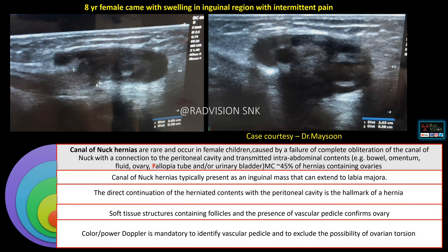Canal of Nuck hernias are rare and occur in female children — this is due to failure of obliteration of the Canal of Nuck. A direct connection of the herniated contents with the peritoneal cavity is the hallmark of this hernia. Contents can be bowel, omentum, fallopian tube, or urinary bladder, but most commonly ovaries. Whenever ovaries are identified, use color Doppler or power Doppler with adequate PRF settings to rule out ovarian torsion, as ovaries in Canal of Nuck hernias are more prone to torsion. Thanks to Dr. Maysoon for contributing this case.